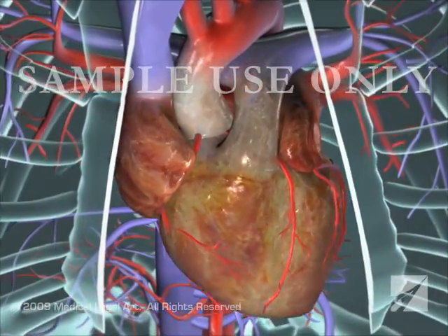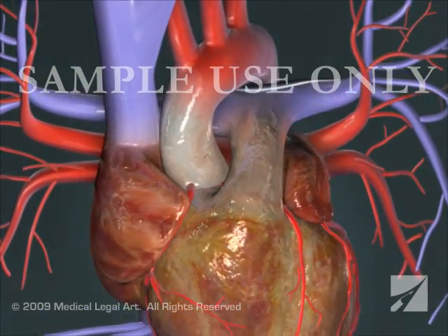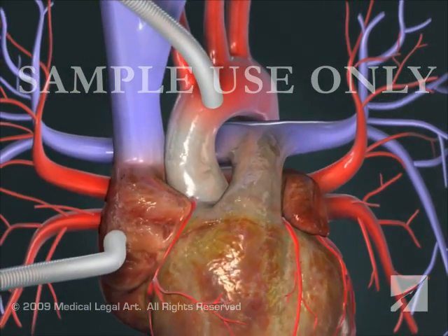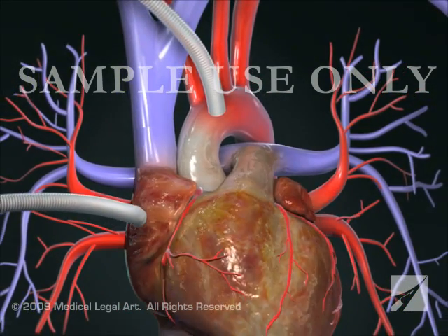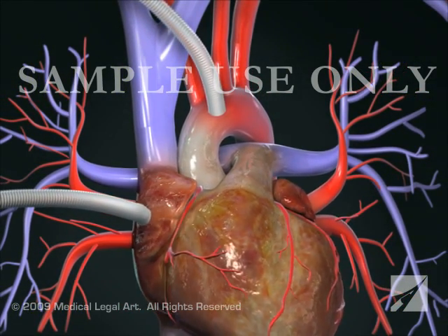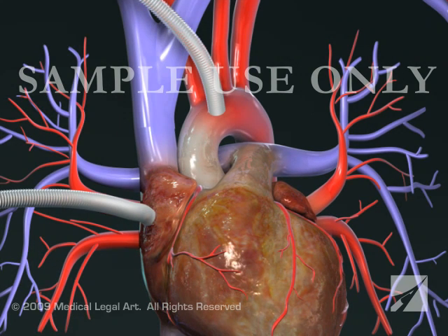Throughout the procedure, your circulatory system will be connected to a cardiopulmonary bypass pump or heart-lung machine. This machine temporarily performs the functions of your heart and lungs during the surgery, allowing your heart to be stopped while the surgeon sews the grafts into place.